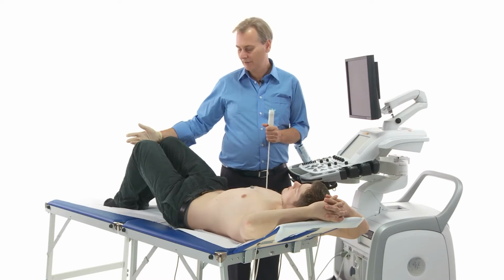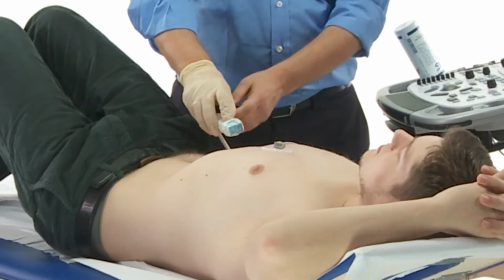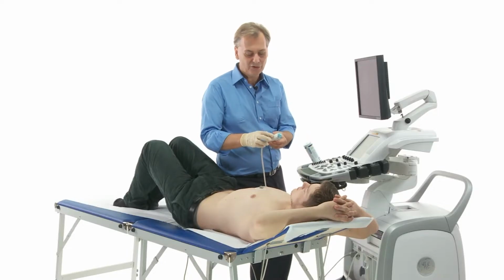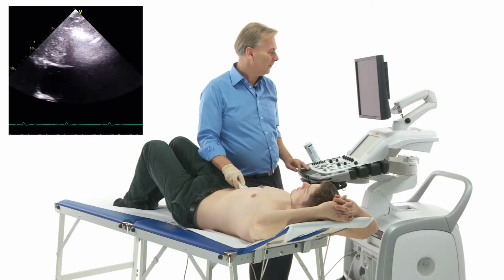First of all, the positioning. You can optimize your image if you have a patient whose abdominal muscles are relaxed, so let the patient put his legs into this kind of position. The next thing, don't forget to hold the transducer on the top. That allows you to be very shallow with your imaging orientation. Then let the patient inhale while you move the transducer towards the heart. And remember, the marker of the transducer is pointing to the left, and you're imaging more towards the left shoulder. So, inhale.